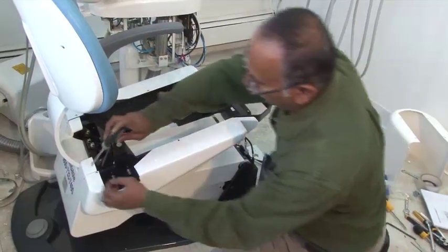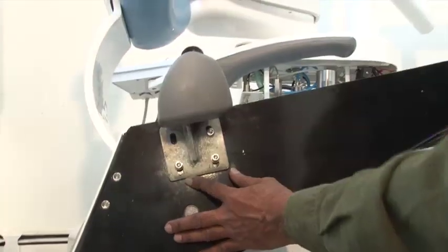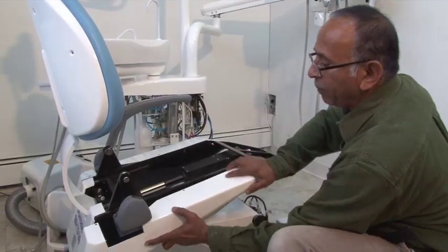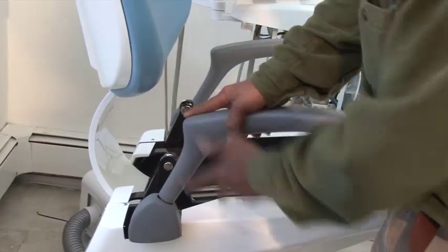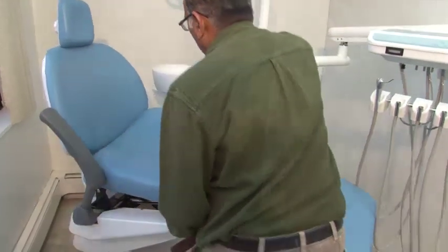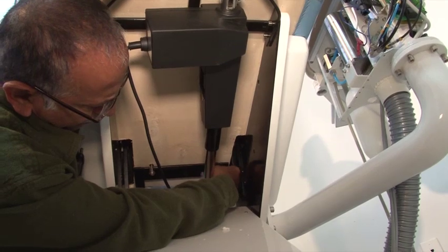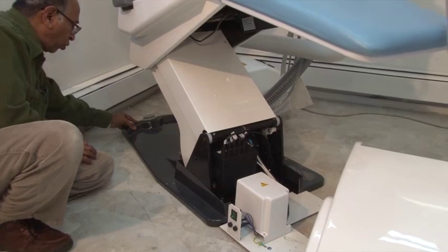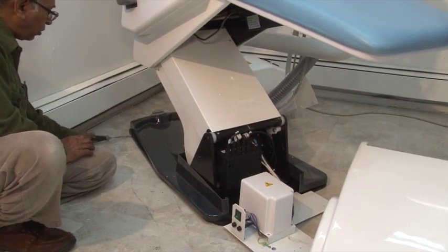To fix the armrest, remove the plastic cover and attach the armrest holder into the chair frame. Place the plastic cover back on the chair and fix the armrest. To rotate the armrest, you may pull it up and rotate. Now attach the seat to the chair and place the black plastic base cover, adjusting the screws on the base so that it will fit tightly.